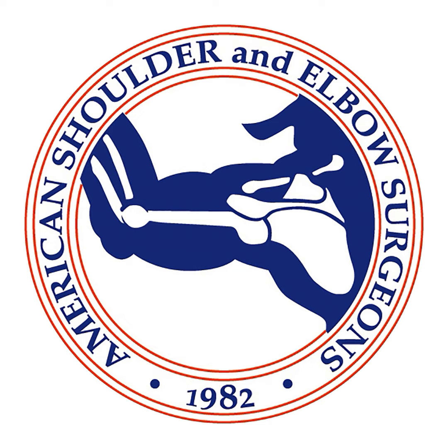But if it's a smaller type 2 tear and I'm going to put a patch on it, what I like to do is actually just measure the patch, and I'll pull the patch in just with a passing suture. And then I'll pass all the sutures inside the joint rather than do it ex vivo. And that way, once you get it secured immediately by going through with a shuttling device through the graft, you get it secured down.